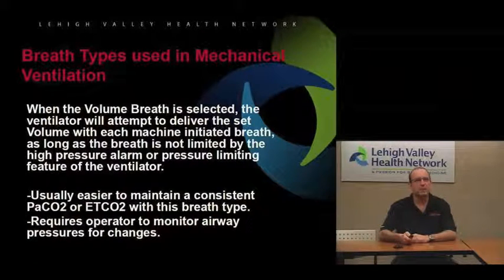the infants. When the volume breath is selected, as we mentioned, the ventilator is going to try to deliver that set volume, the volume that's set by the operator. The only thing that might limit it might be like a high pressure alarm, or actually on the T1 ventilator, if you get within 10 centimeters of water pressure of your high pressure alarm, it's actually going to start limiting the breath some. Something you need to keep in mind when you're using the Hamilton T1.